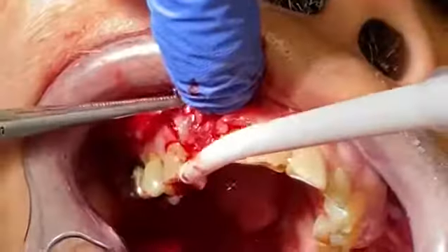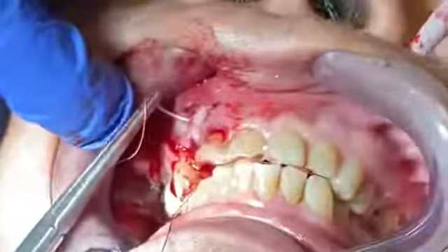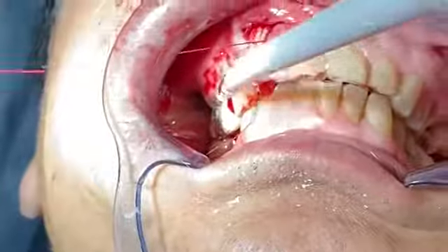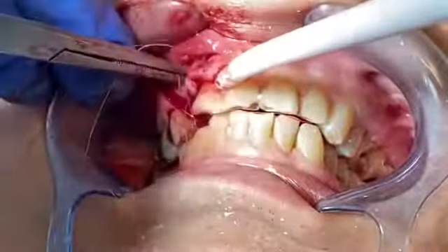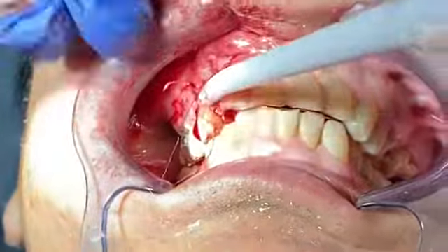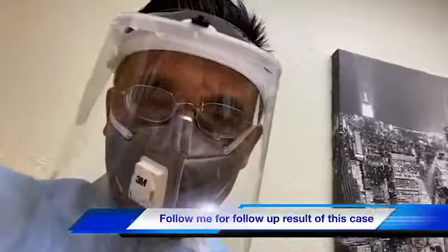If you put the bone graft in, you might have problems. So here I make the vertical incision on the adjacent tooth number 5 and release it, so that when I suture up, I can close that defect space there. There are many other flap designs — this is just my way, and I'm hoping that I can share the result in a few weeks so you can see how the defect heals.